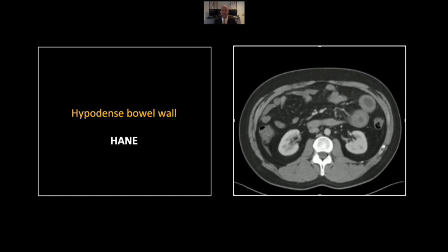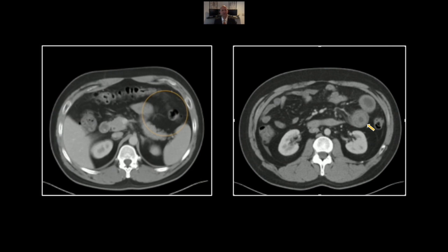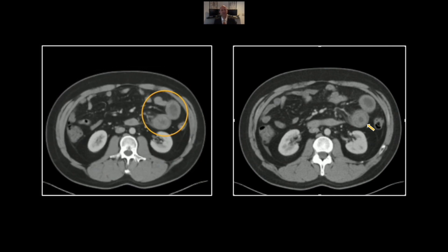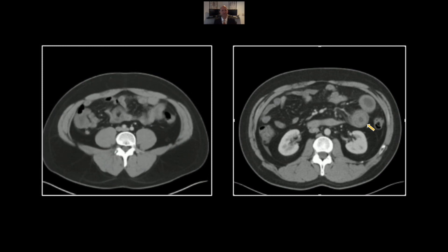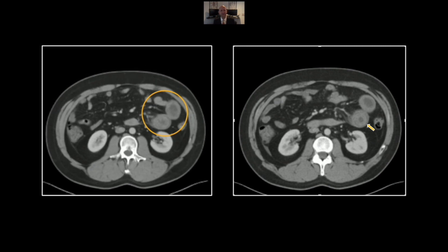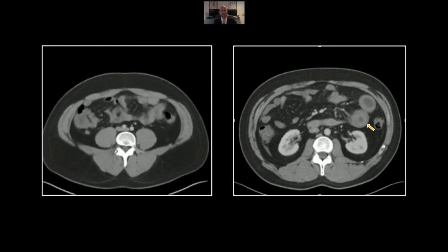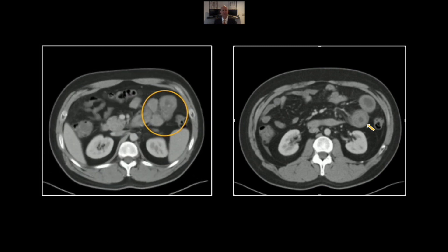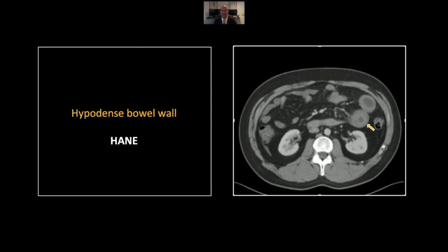Our next case is hereditary angioneurotic edema. Here you can see hypodense bowel wall with stranding extending into the mesentery. This is in a pretty typical location involving the proximal small bowel jejunum on the left side of the abdomen. The differential includes inflammatory and ischemic enteritis as well as small bowel hemorrhage. That is a case of hereditary angioneurotic edema — C1 esterase inhibitor is the pertinent absence here.